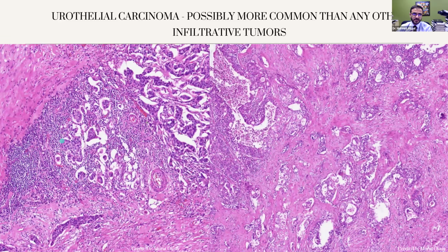That's why one of the first things the urologists want to know is whether the tumor is clear cell renal cell carcinoma or not. Diffuse strong membranous CA9 expression is very characteristic for clear cell renal cell carcinoma, even in the high-grade infiltrative setting. There are exceptions, but most of the time you will see diffuse strong and membranous CA9 expression. And in this tumor, Merlin was lost.